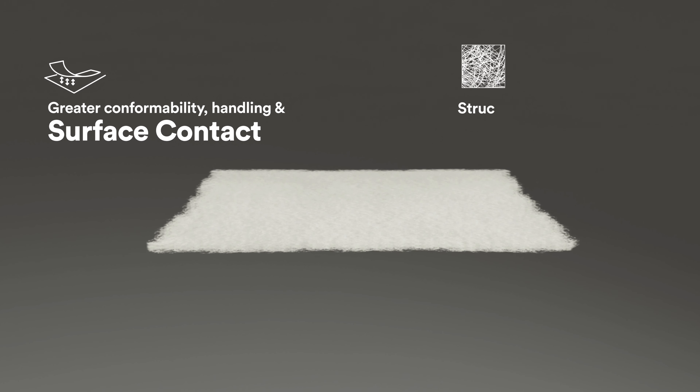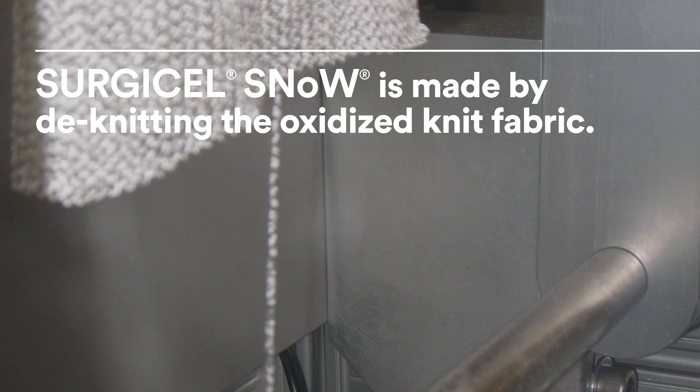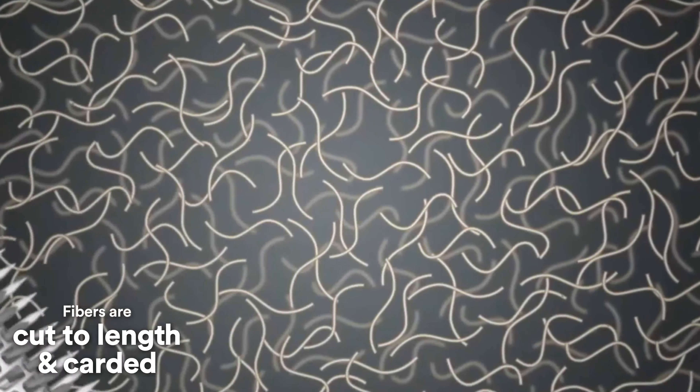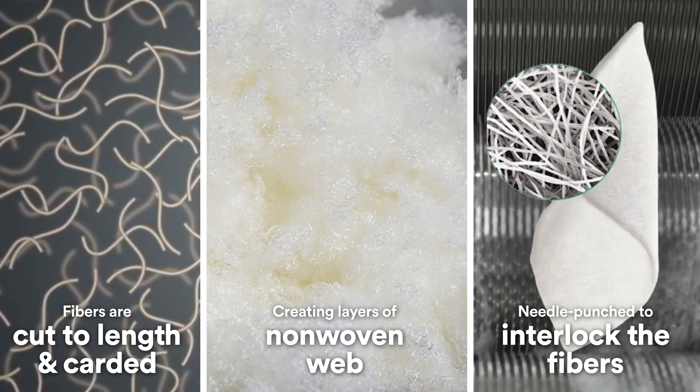A breakthrough absorbable haemostat whose structured non-woven form can be inserted easily through a trocar. Surgicel Snow is made by de-knitting the oxidized knit fabric. The fibers are cut to length and carded, creating layers of non-woven web that are then needle-punched to enlarge and interlock the fibers.